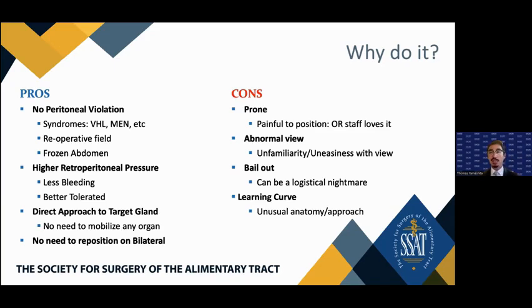Whether it's a hand port, a stapler, suturing from the back, flank exploration, or flipping on an emergent table, those are all things that you have to think about, talk about extensively with the team, and have all planned out from the beginning, and make sure that everyone is comfortable with the steps. Because when things are happening, there's no time to dilly-dally. It's fast. And it comes with a learning curve because of the unusual anatomy and approach.